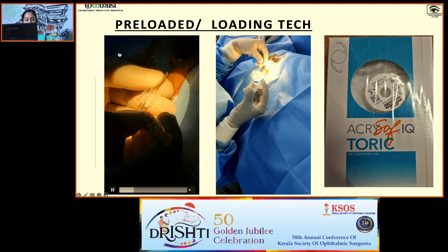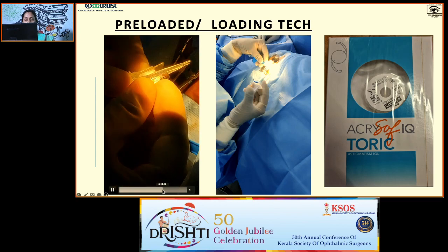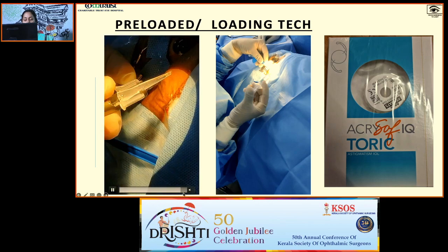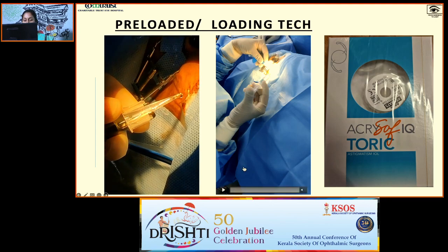Should be placed inside the cartridge as per the instruction, and the cartridge has to be fitted into the injector system, and you can check the movement of the lens by pushing the plunger. If it is moving properly, then it is ready for injection. This is the Indian system Suprafob that is loaded as per the instruction.